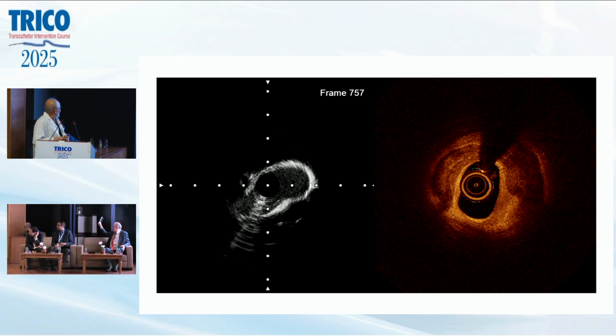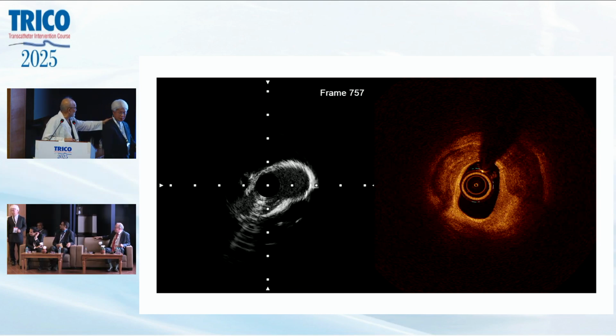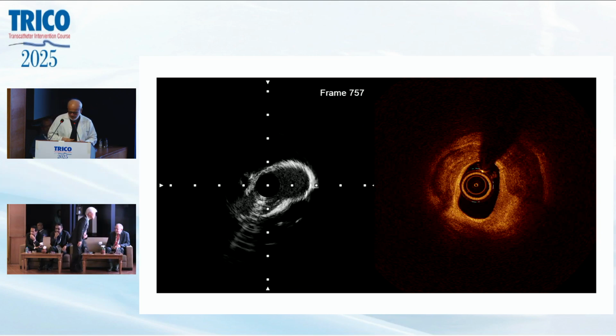So I was discussing, Professor Akasaka, that we have this investigator-initiated study, IOPUS, where 72 cases of simultaneous IVUS and OCT of the same frame have been taken up, just for a proper understanding and learning. And this is 360 degree looking in IVUS like this and OCT like this.